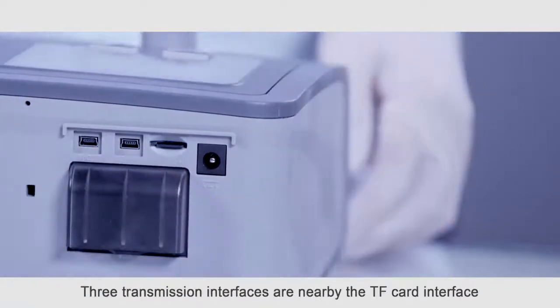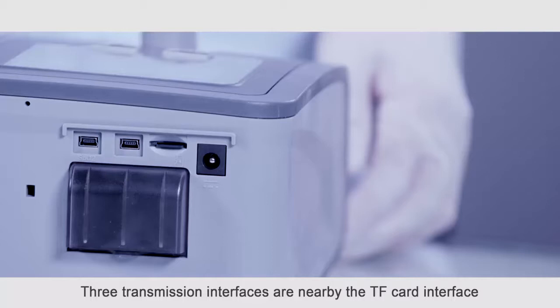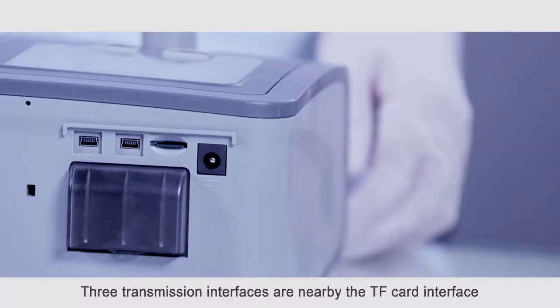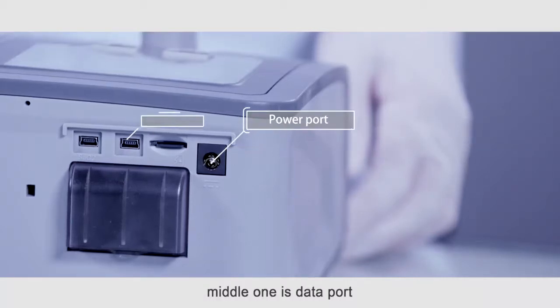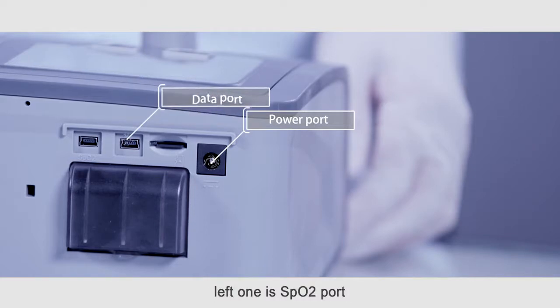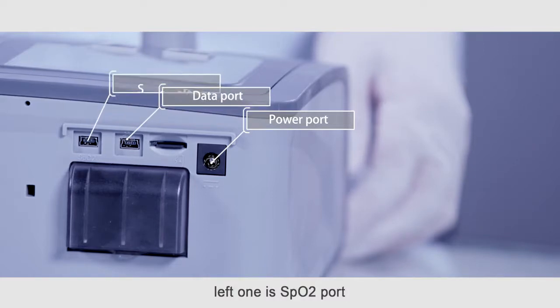Three transmission interfaces are nearby the TF card interface. Right one is power port, middle one is data port, left one is SPO2 port.